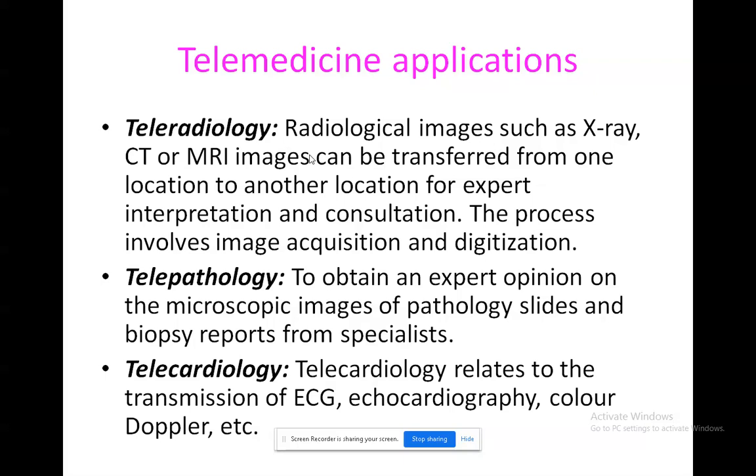Telepathology means microscopic images, which we can't see with the naked eye, which can be seen only through the microscope. Those images will come under telepathology.